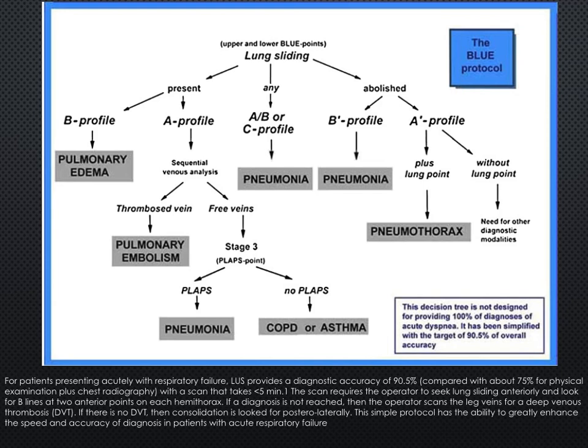And it guides you through a process really of looking from point to point and guiding you towards a diagnosis of some of the findings that you might find. We'll go through this in a lot of detail when we talk about interpretation of our pathology and looking at especially aeration, but also pneumothorax and to a point as well our pleural effusions.